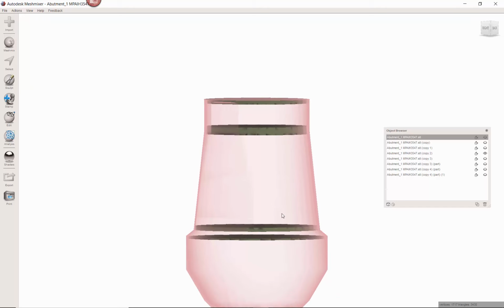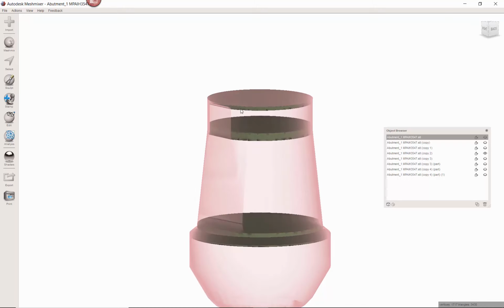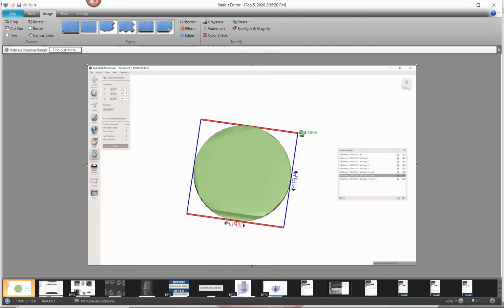And so what I'm going to do, and what you would do in real life, is you're going to measure the diameter here. You're going to measure the diameter there. You're going to measure the diameter here, and you're going to measure the diameter here. So digitally, you're just going to take your calipers manually and just measure those. To see what I did in the software, again, you wouldn't do this in the software. You just bring the abutment in the software, but you can see where I generate a number. 4.2 millimeters is what I estimate.